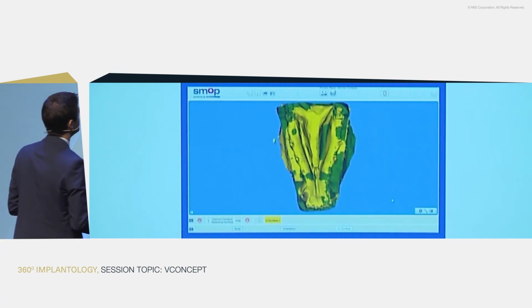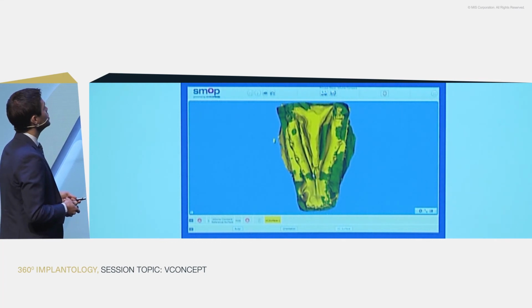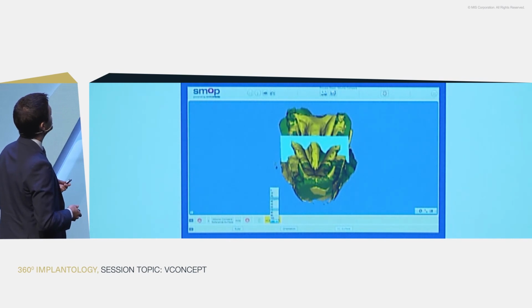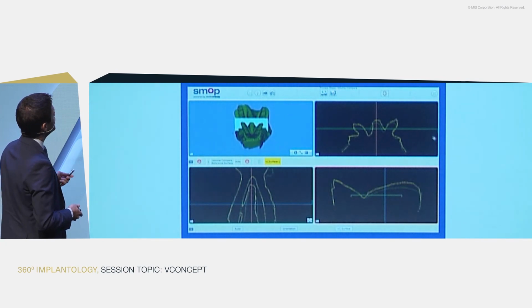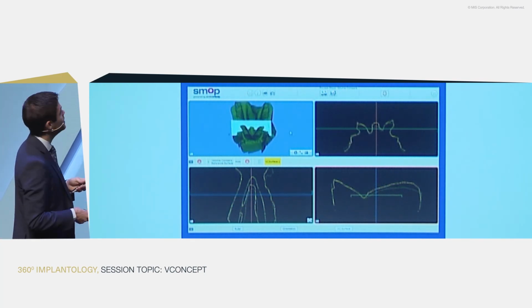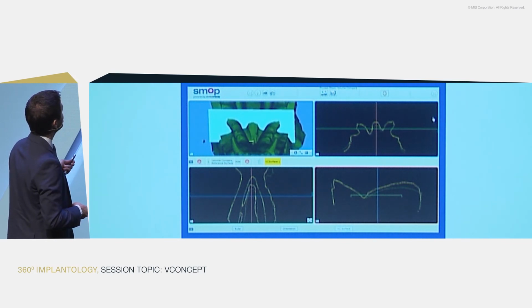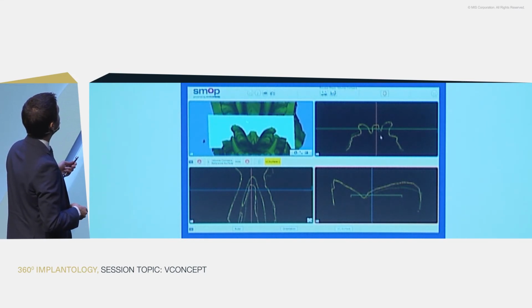So after that's been done, and we have the matching of the two surfaces, we're going to go ahead and look at this blue slice, and I'm going to go ahead and hide the preoperative view, so we're only seeing now the postoperative view. Now you can see that we will scroll this blue image so that we can have cutting these two implants evenly. These are two immediate implants that you can see. Here are the ones on the healed ridge, and then we're scrolling this slide to have both the right and the left side with the slide being cut evenly.